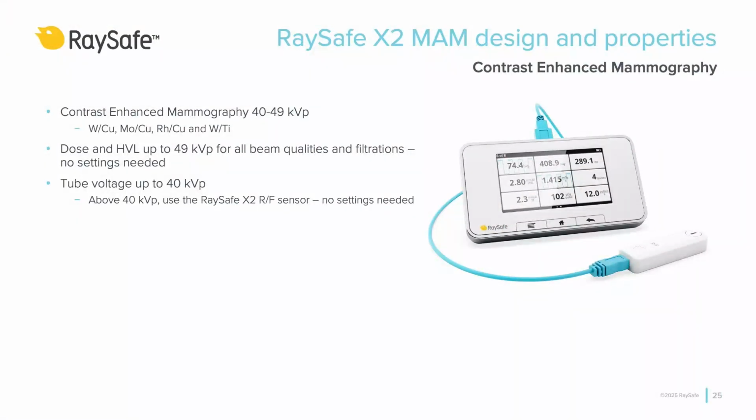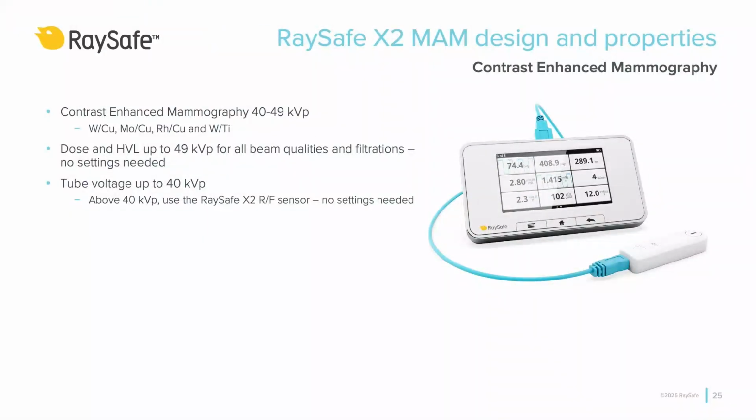A few words about contrast-enhanced mammography as well, a method usually used if the screening indicated something abnormal. Some machines have optional dual energy or contrast-enhanced mammography. These machines make 2 exposures, one with normal screening settings, and a second with higher kV, usually above 40 kV, and high filtration of copper or titanium. The second exposure is usually either tungsten copper, molybdenum copper, rhodium copper, or tungsten titanium.